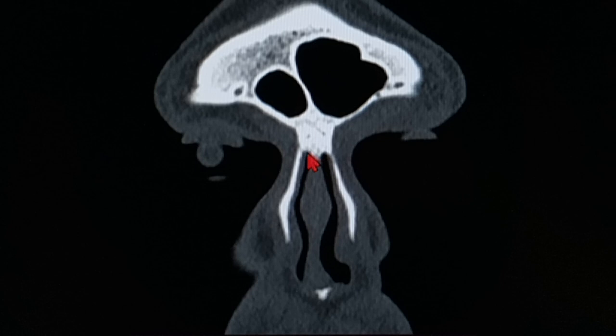So this is basically a bony window I'm trying to show you. This is not a soft tissue window. This is a bony window because you can actually see the bone marrow, the proper structure of the bone, much more clearly as compared to the soft tissue right there.